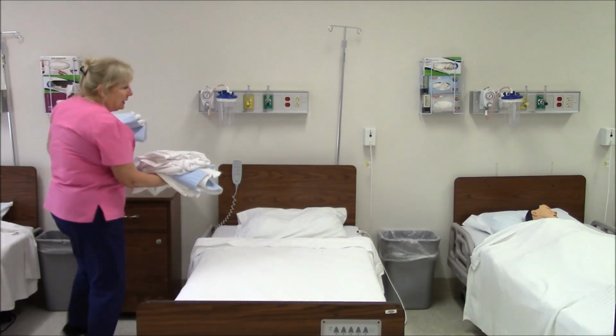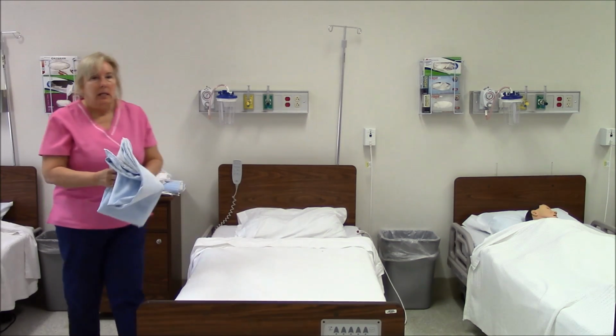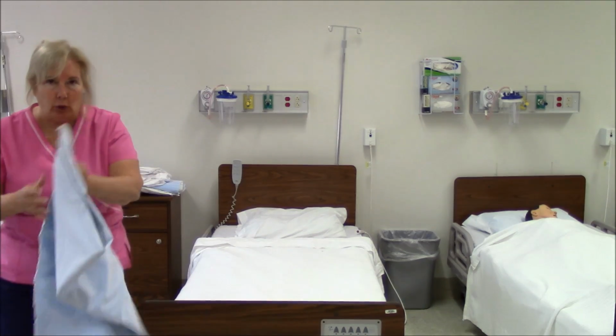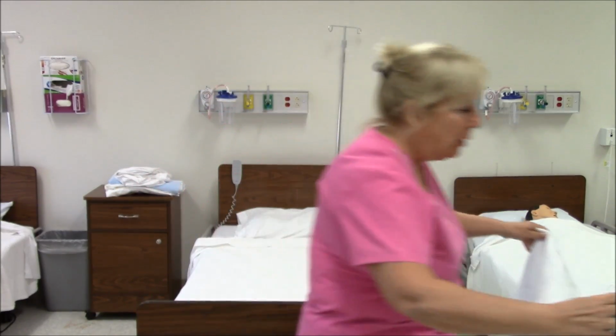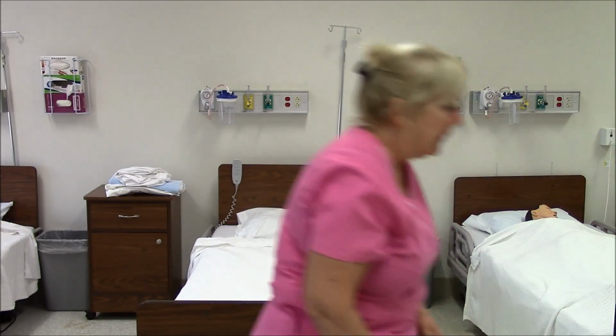I'm setting my linen on a clean surface, which is the patient's nightstand. I have my bed pad, which will be my dirty area, because as we know, we would never put linen, even though it's dirty, on the floor. I do put it on the patient's chair. I'm now ready to make the closed bed.